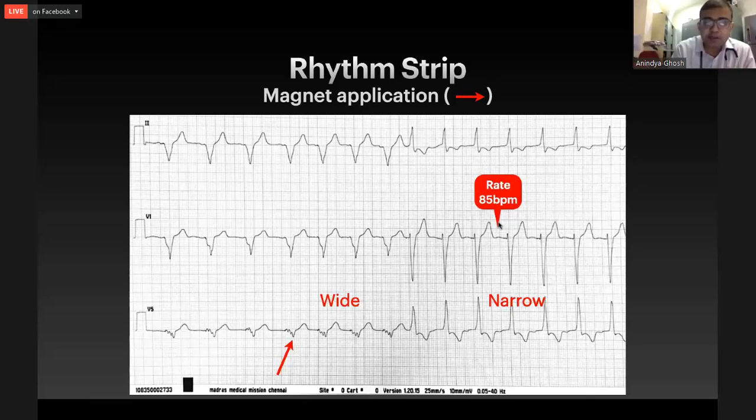After that, the pacemaker normally goes to the magnet rate, which is 85 for beginning of life and 65 for an ERI indicator. The pacemaker went to 85 beats per minute, all right, but the QRS morphology changed. It became, from such wide QRS complexes of an RV apical pacing morphology, sleek, narrow QRSs. Now, how is that possible?